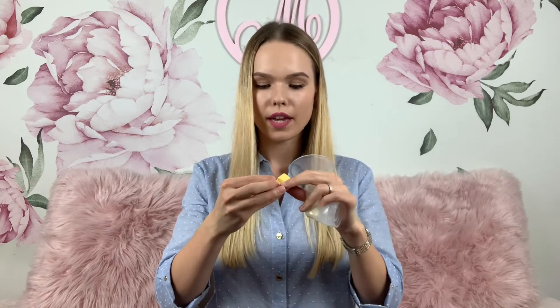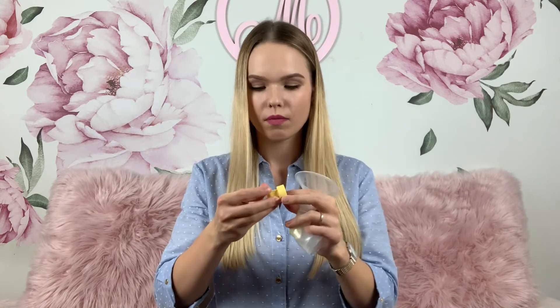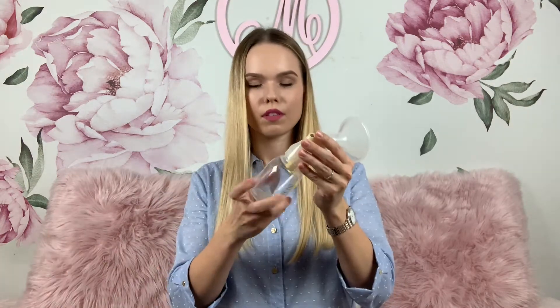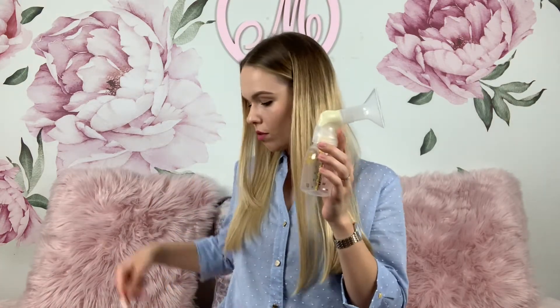Now you're ready to get to these two parts: this is the valve and this is the membrane. You need to snap this little white thing into the valve until it lays flat like this. Now you're ready to screw it into the other side of the body, then screw on the bottle, and finally insert the remaining end of the tube on top — and that's it, you're ready to go!